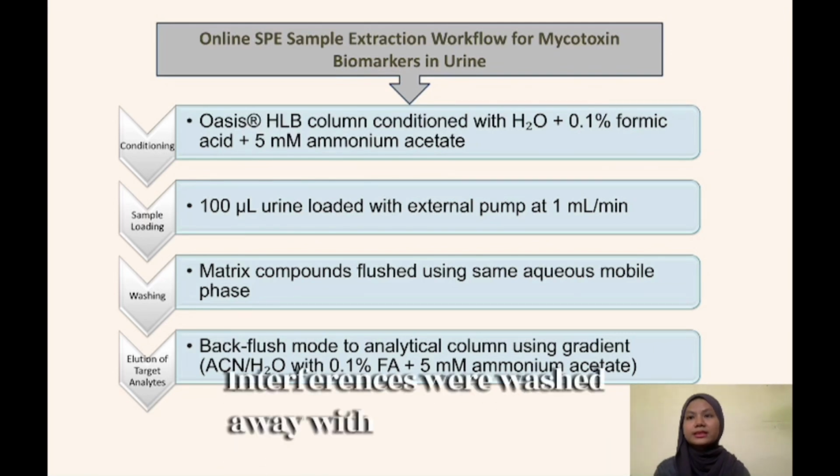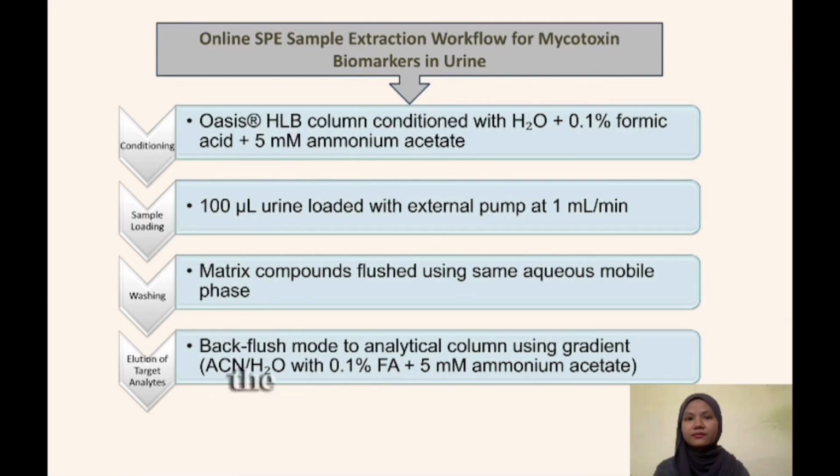Interferences were washed away with the same mobile phase, and after 2 minutes, the valve switched to allow backflush elution of the target analytes to the analytical column. This setup minimized manual handling and enabled sensitive, high-throughput analysis.